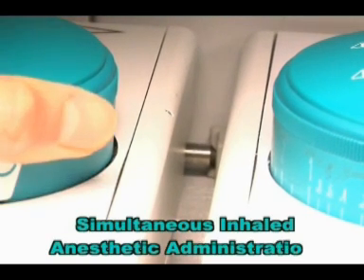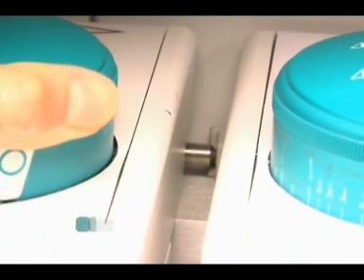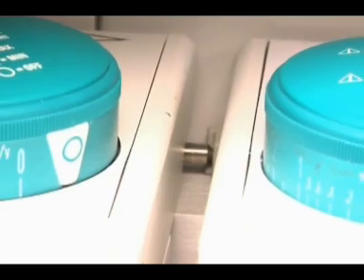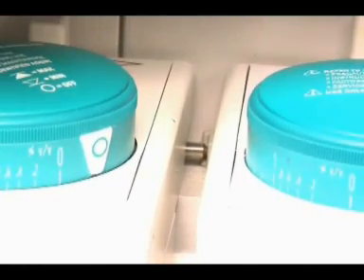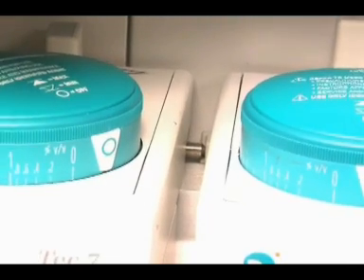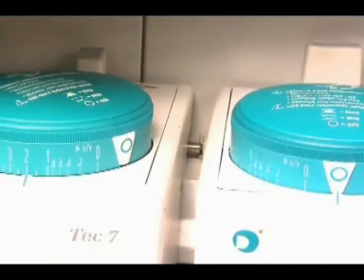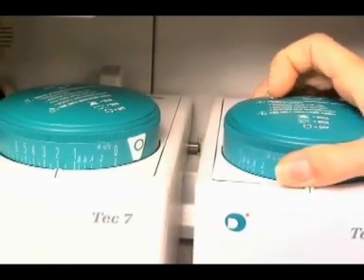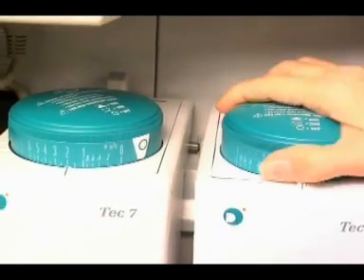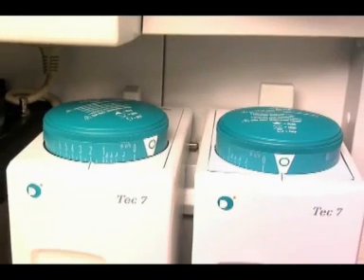Simultaneous inhaled anesthetic administration. Newer machines have a vapor interlock system that prevents simultaneous gas administration. However, some of the older machines do not have the vapor interlock system, allowing two gases to be administered at the same time. Therefore, the provider must be vigilant to make sure that only one anesthetic gas is being used.